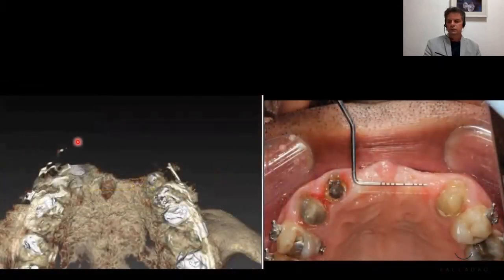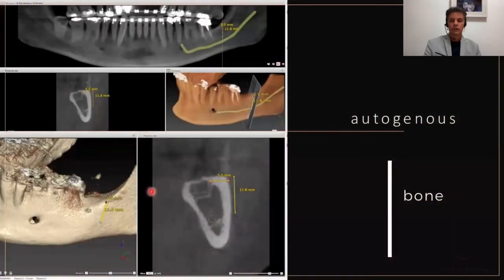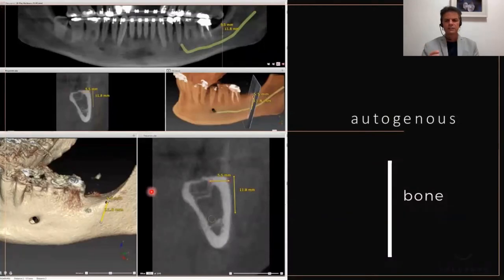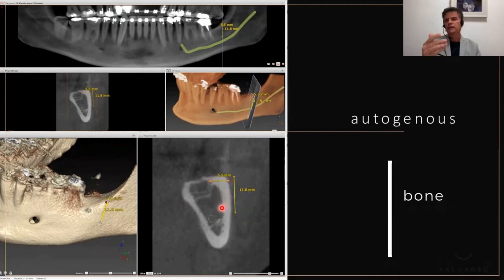This is an occlusal view. Notice the enlargement of the incisor foramen. We use the same software to analyze the posterior mandibular region, from where we are going to obtain the autogenous graft. There is a nice amount of bone available, so it will be very safe. We also want to use bone scrapers, so it will be less traumatic for the patient.